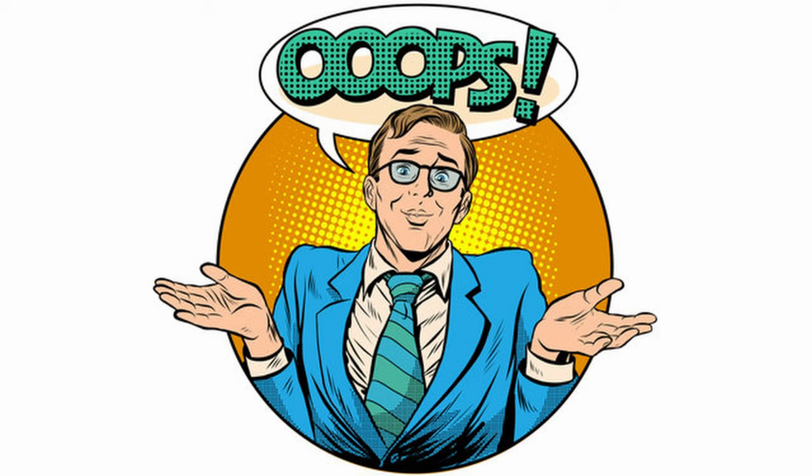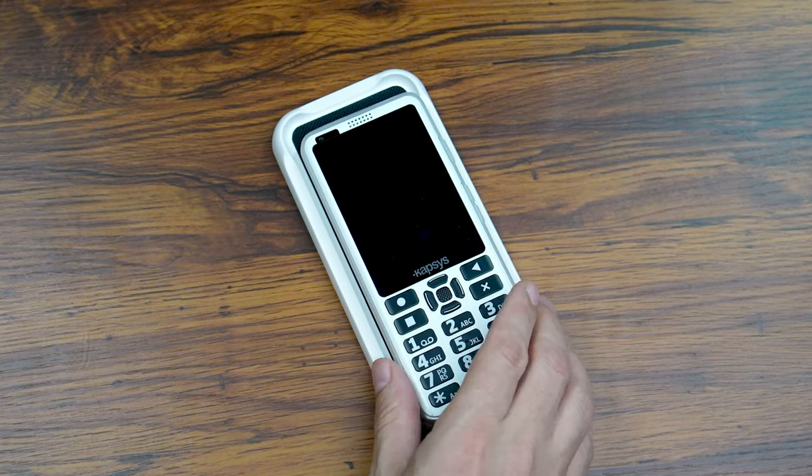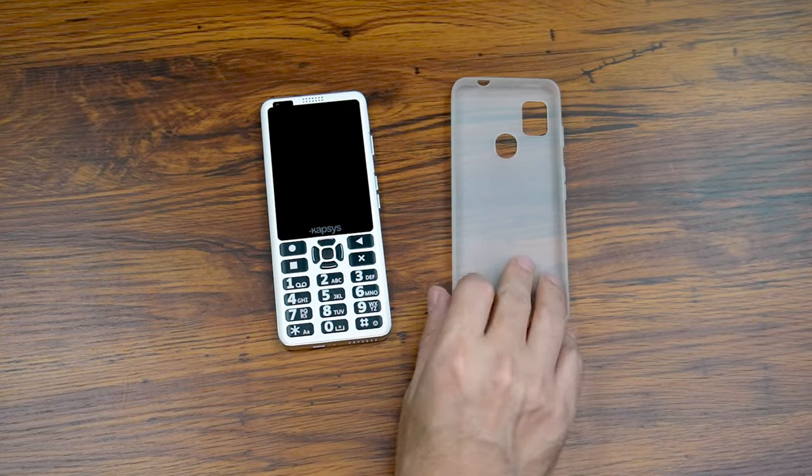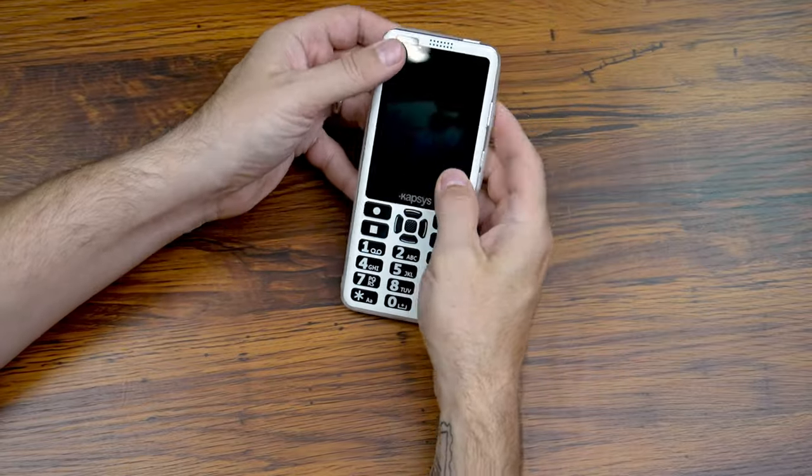Regarding price, there are two packages. The basic package includes the smartphone, USB Type-C charging cable and wall plug, a set of earbuds, and five NFC tags, and costs $539. The premium package adds a wireless charger, a flexible soft TPU frosted semi-transparent case, a lanyard, and a cleaning cloth — all for $599.